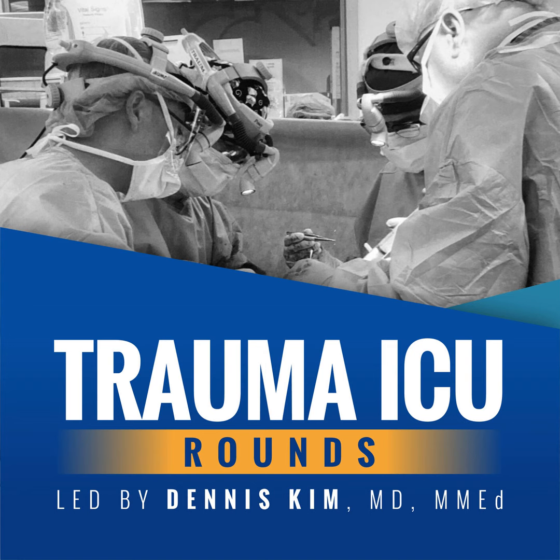So before we end, I do want to quickly go over how we think about modes of ventilation. And what do we mean by a mode? Quite simply, a mode is a particular pattern of spontaneous and mandatory breaths delivered by the ventilator. And in my mind, I always have 3 key factors that I want to think about when I'm trying to determine or describe a mode of ventilation. Those factors are, number 1, the type of breath, number 2, the targeted control variable, and number 3, timing of breath delivery.